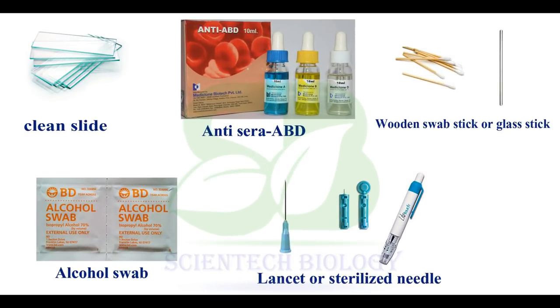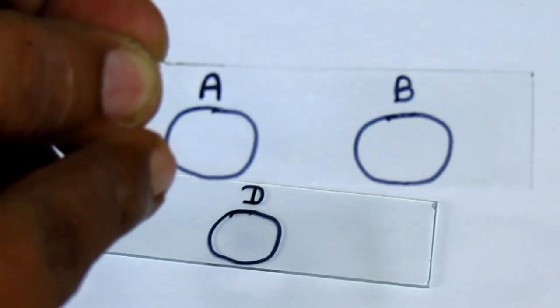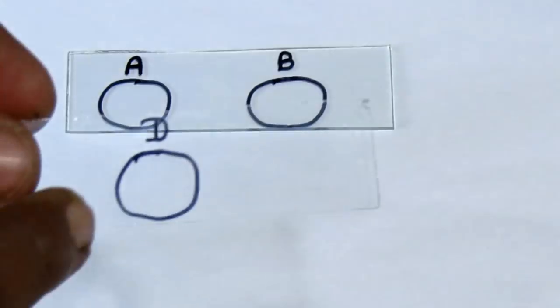To check blood group at our home we require a clean slide, anti-serum A, B, and D, some wooden swab sticks or glass rods, and an alcohol swab. Take two separate slides labeled as A, B, and D.